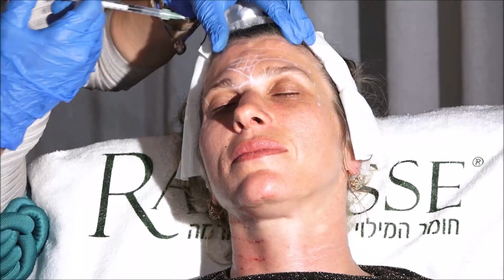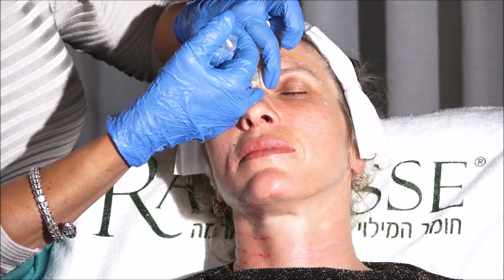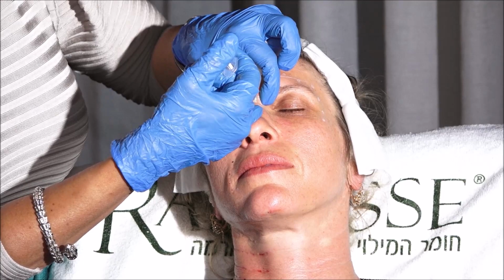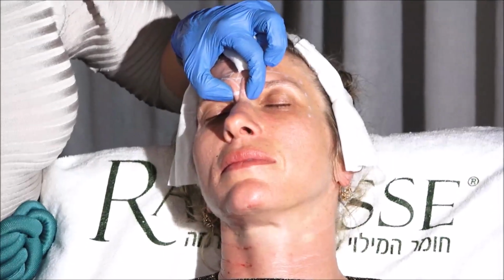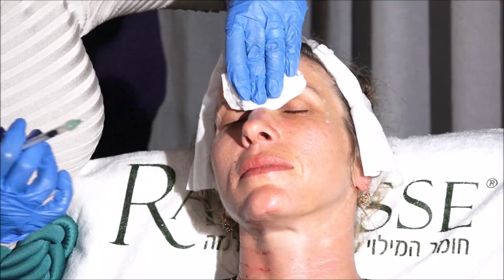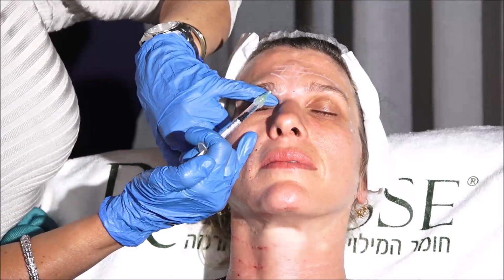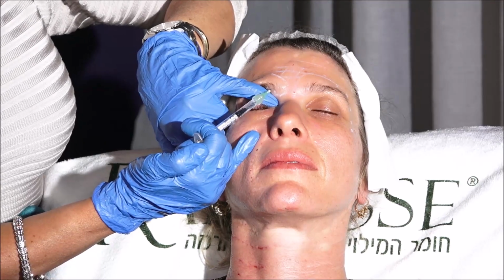So I'm doing her glabella, procerus 90 degrees to the bone, 5 units. This is 2 units per trace because it's more concentrated. So I only put 5, it's 2 traces and a half. What I want to show is this. She has a smaller orbit. We have to go 90 degrees to the orbit, not to the skin.